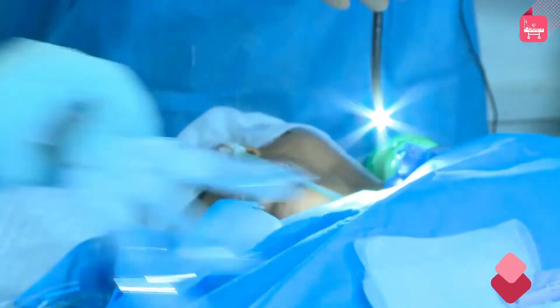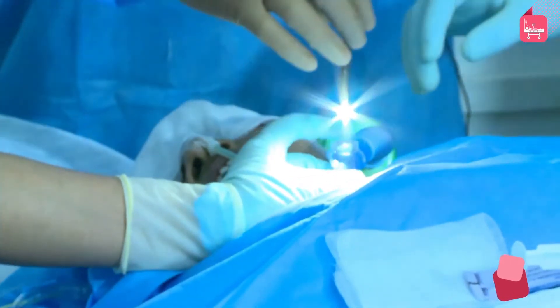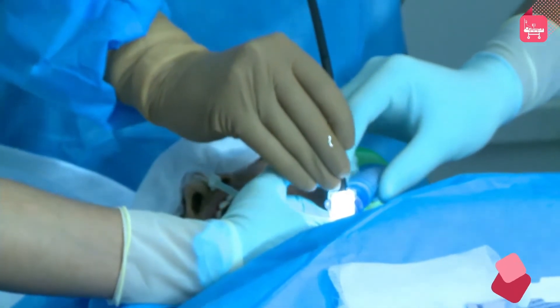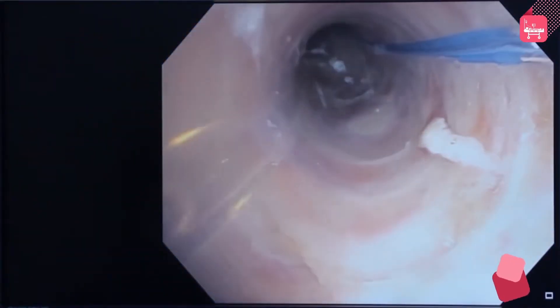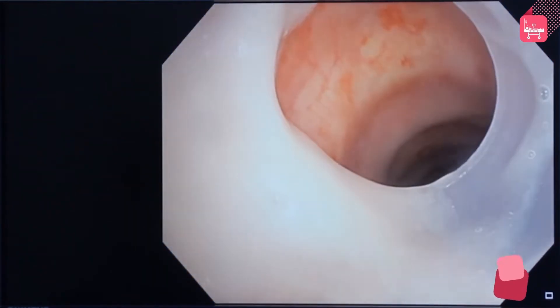Position the patient on the ventilator, and once the patient is tracheostomized, insert the bronchoscope into the catheter mount and further into the bronchoscopy port. Always maintain the fraction of inspired oxygen at 100% throughout the procedure. Insert the bronchoscope into the tracheostomy tube through the catheter and mount slowly into the trachea.